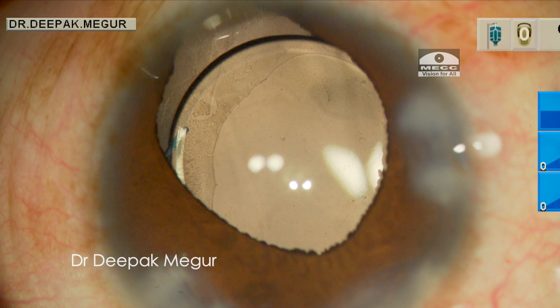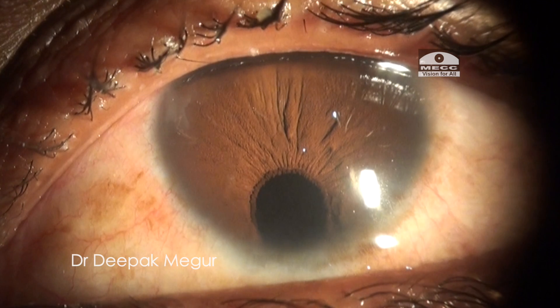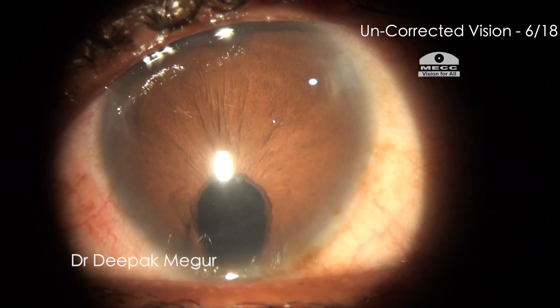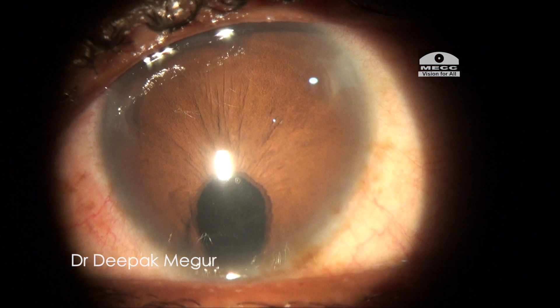The lens appears to be fairly well centered, and this is how the eye looks on the next post-op day. Eventually the patient did well and she was happy with the visual outcome. Thank you for your attention. I hope this helps.